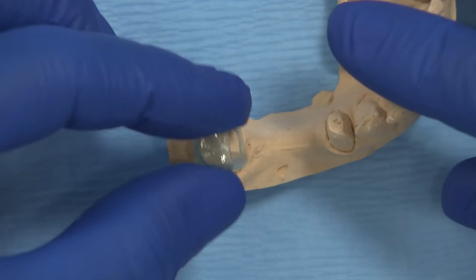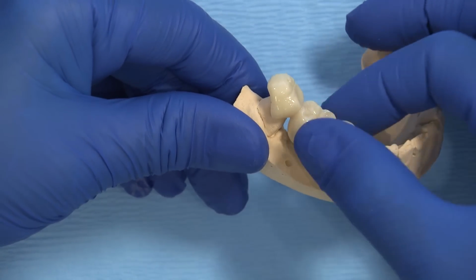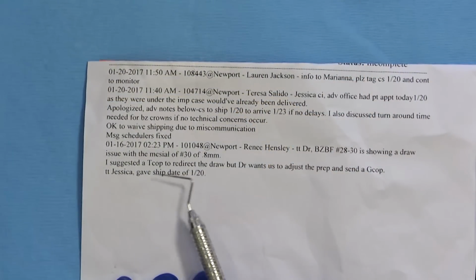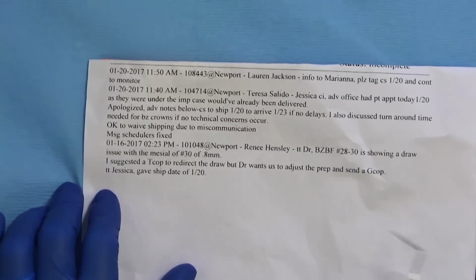I prefer this better than having the lab calling me later telling me to reprep. The second option is to use a reduction coping. Usually when the bridge wouldn't draw, the lab will give a call and say that the preps need more taper, need to be prepped more, and if you don't want to reprep, they can send a reduction coping indicating the amount to be reduced for the bridge to fit.